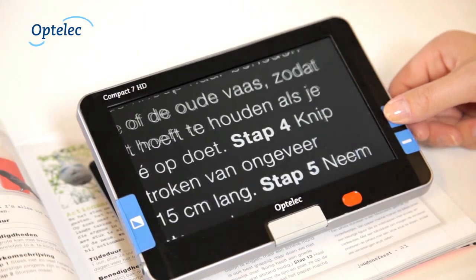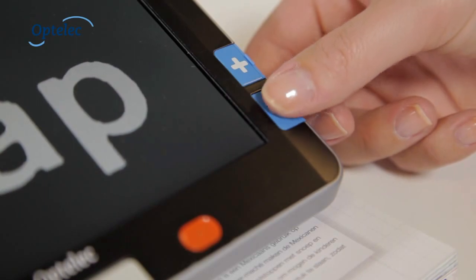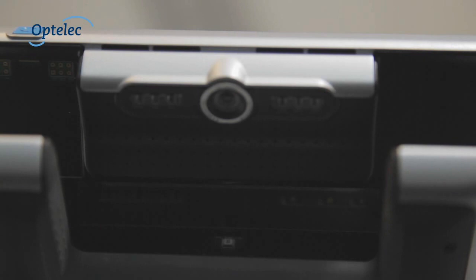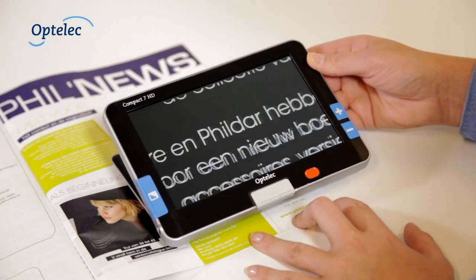To adjust the magnification, press the plus or minus button. The Compact 7 HD is designed to slide over documents smoothly. The unique lighting concept creates an even image which is not affected by light reflections.